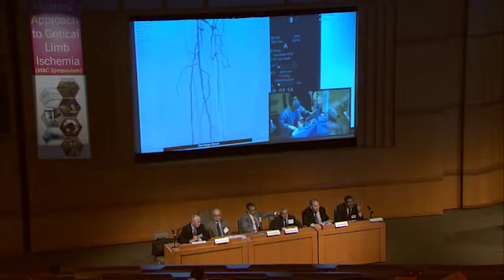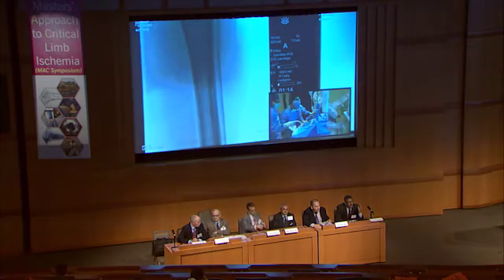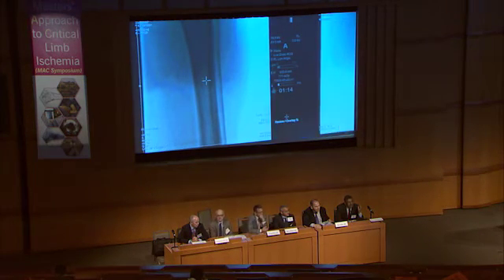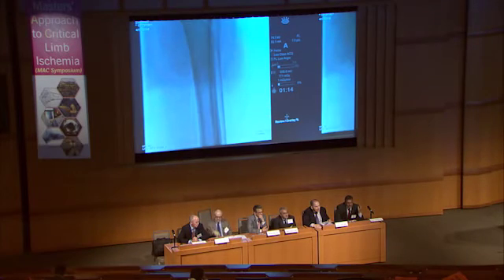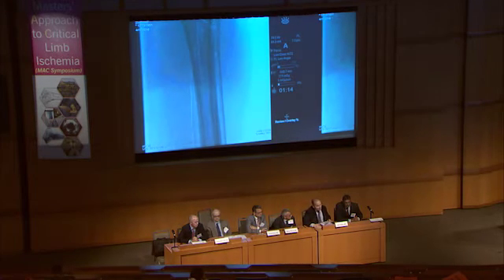Yeah, I agree as well. I would fix all three outflow vessels. Then I'd reassess how much flow we have in the AV malformation to determine whether or not this is something we have to do now, or at least make some attempt at now, or stage. I agree, Craig. I think it's a provocative question about what's going to happen to that flow through the veins there. I predict that it won't change, but we'll see. I don't think it needs to be fixed today at the same sitting.